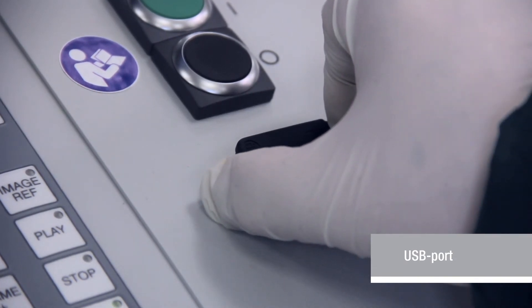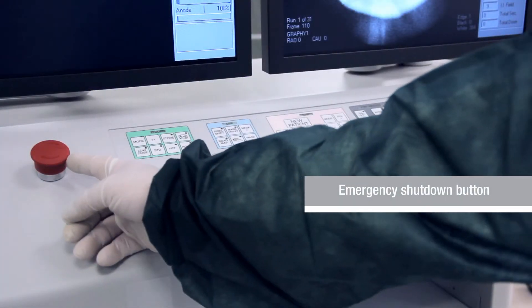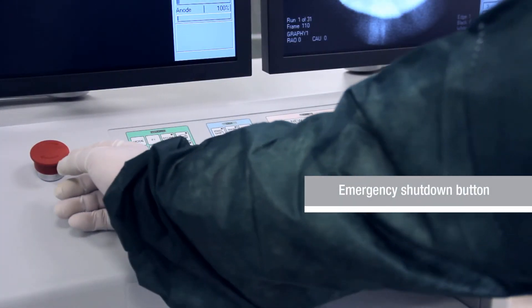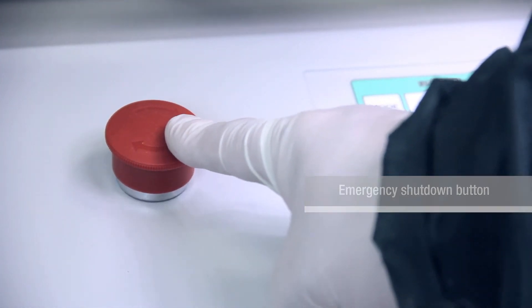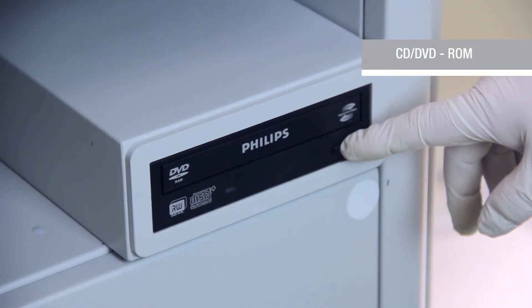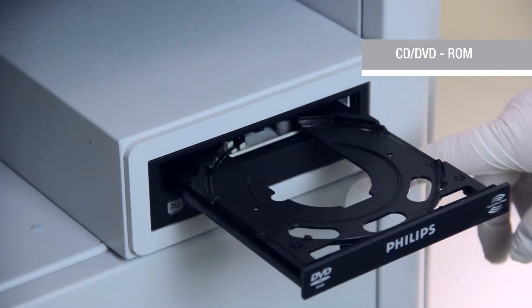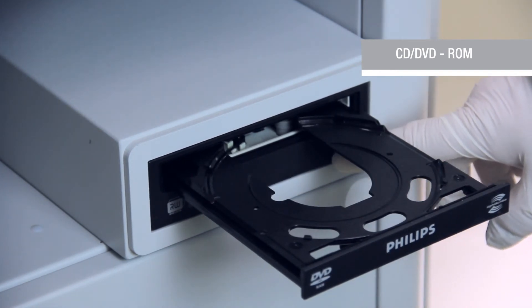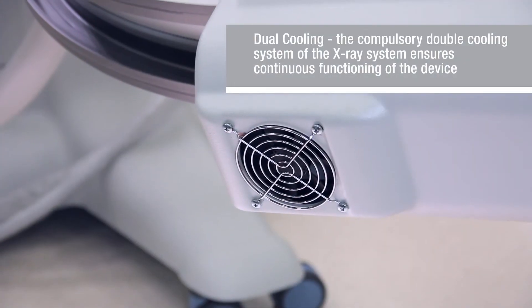All data may be saved to any USB flash drive via the USB port. The system can be stopped with an emergency stop button. A DVD recorder also allows saving information about the study.